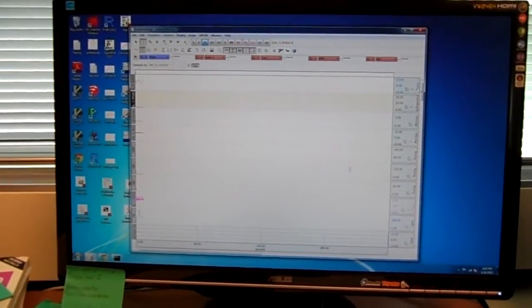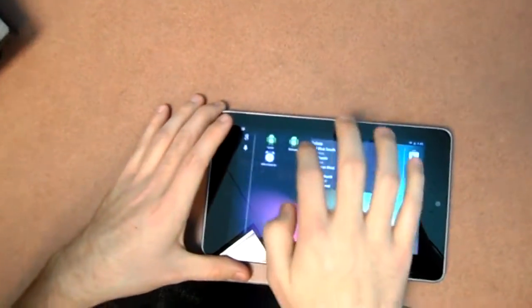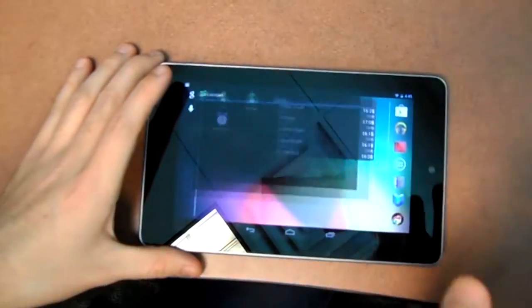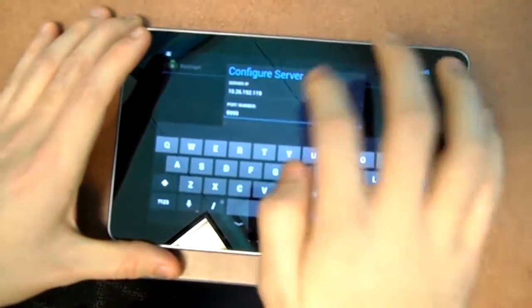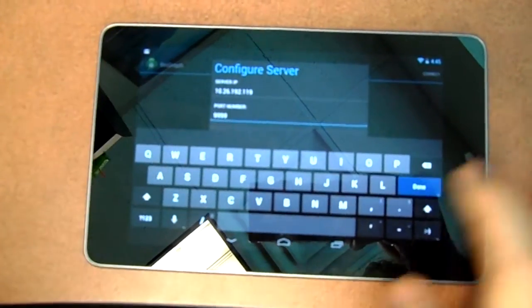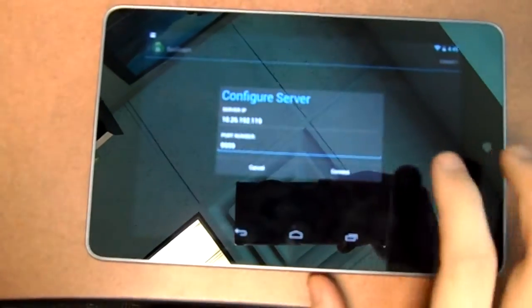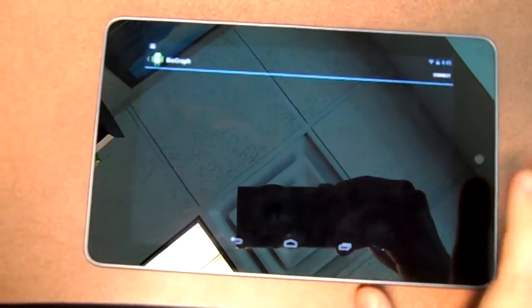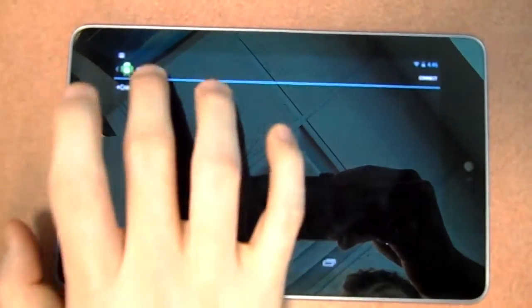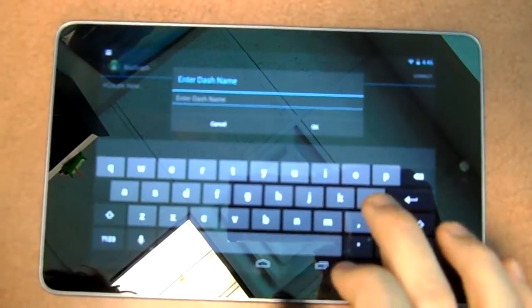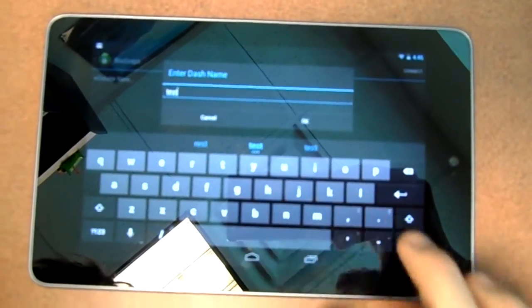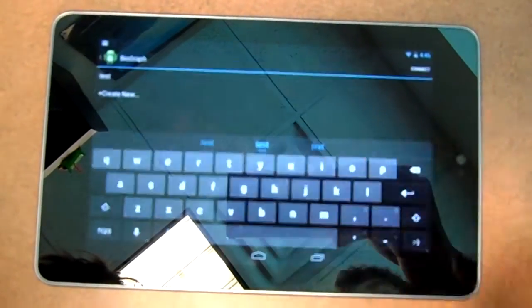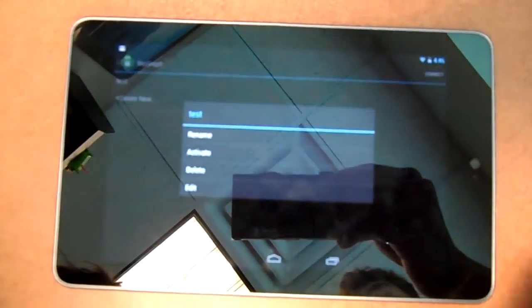Now we can view Cody's graphing application. On the tablet, one just has to launch the application, input the server they're going to connect to, which I've already done here, and say connect. Then one is able to create a new dashboard, which we'll call test, and from there they're able to edit the dash by creating new graphs.